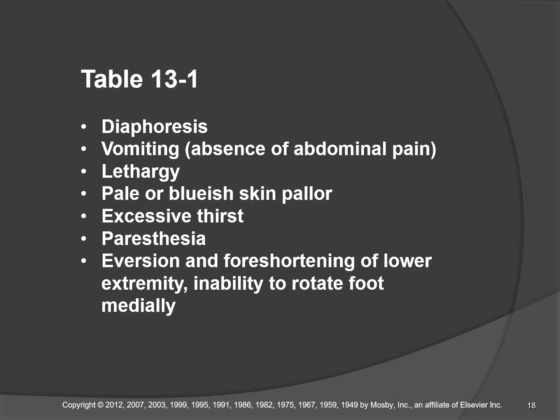Eversion and foreshortening of the lower extremity. Inability to rotate the foot medially. That is the classic sign for a hip fracture. Okay. So you should recognize all these as your patient's body is basically telling you that they are positive for fracture, or the injury is real, if these symptoms are manifesting. So pay attention and understand that you're not just there to get your x-rays, you're there to serve the patient. And if you see some of this stuff, respond appropriately. In particular, if you see the last one, do not frog their leg.